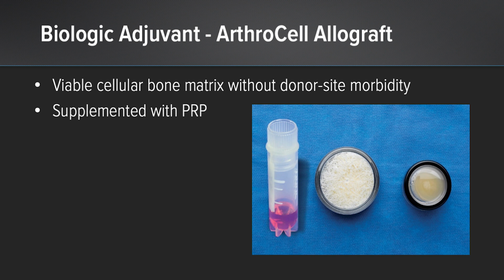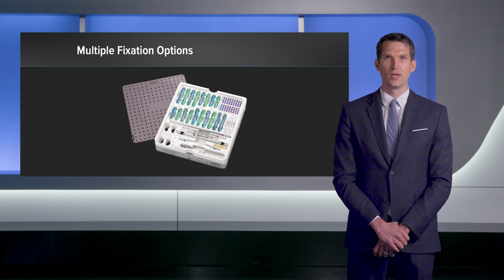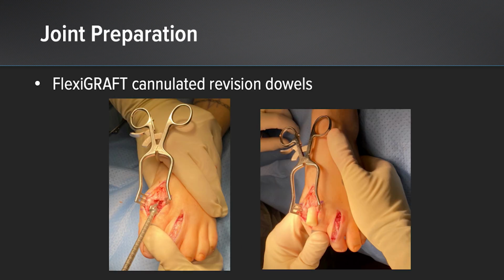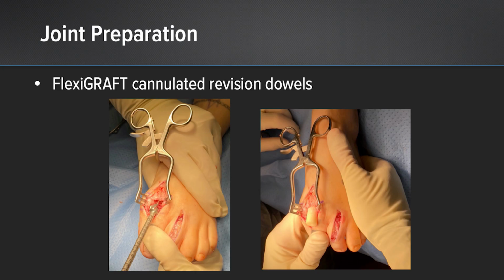Multiple plate fixation options are available in the metatarsophalangeal joint fusion tray. There's low-profile straight plates as well as a metatarsophalangeal joint-specific plate with locking screw options. Here you can see joint preparation with a 12 millimeter reamer to match the 12 millimeter allograft bone dowel. This dowel was then placed intramedullary within the first metatarsal, as well as in the hallux proximal phalanx medulla.